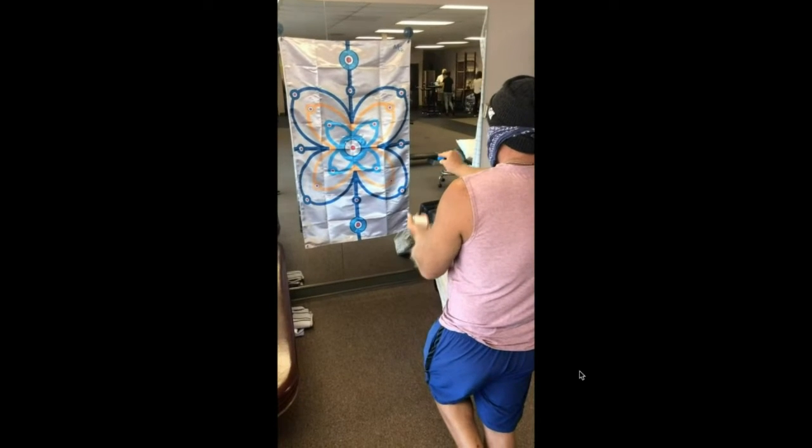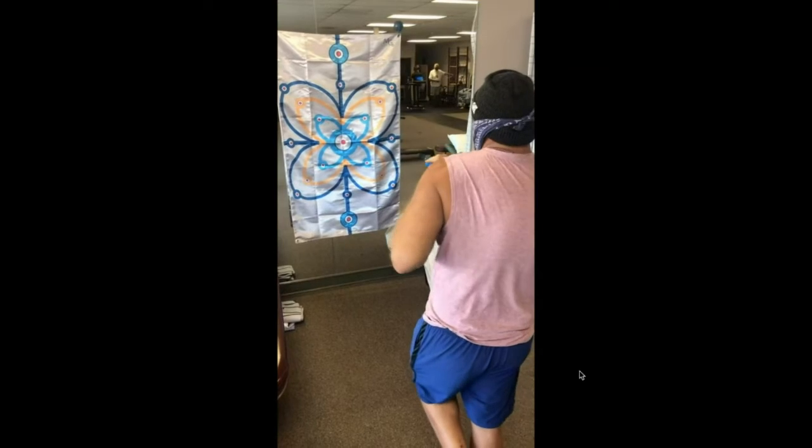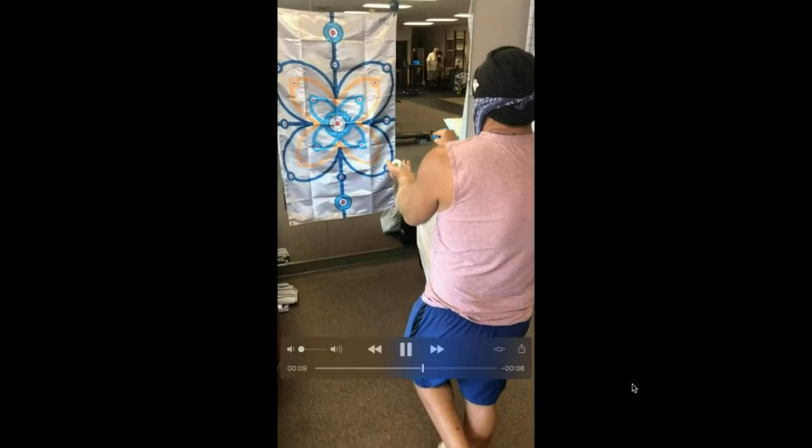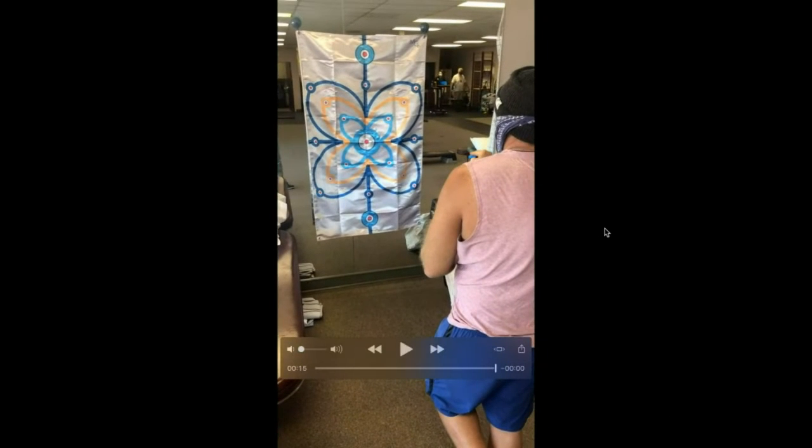Single leg stance, complex movement patterns, maybe some peripheral vision, some dorsal stream vision going on there, dual tasking with a toss and catch there. So this person is post CVA, mild effect.